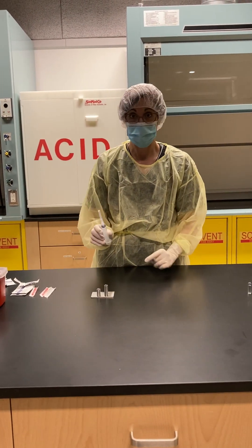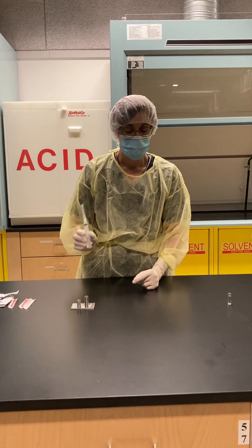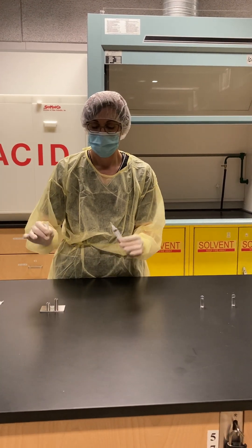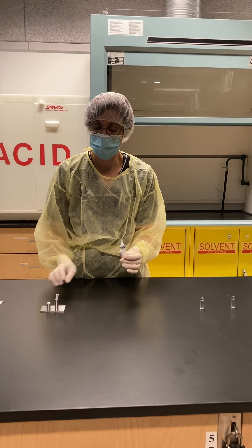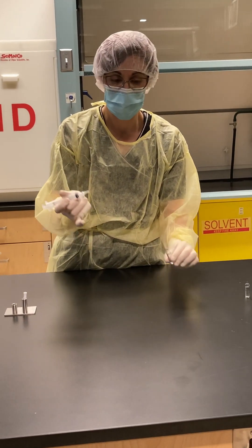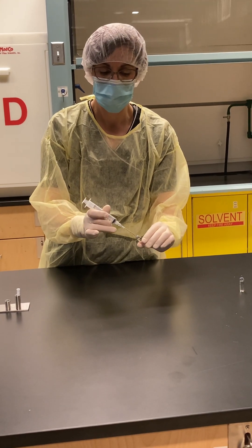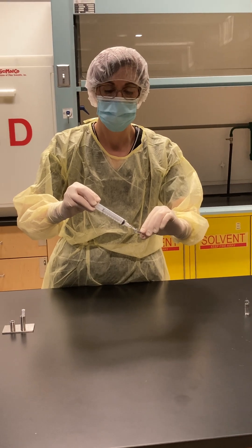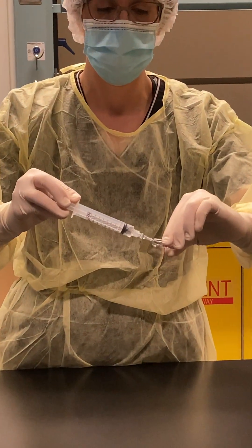Now I'm going to draw up two mils into my syringe. I'll put my needle cap in my needle cap holder. With the bevel down, I'm going to put it in my hand tool and just draw up.